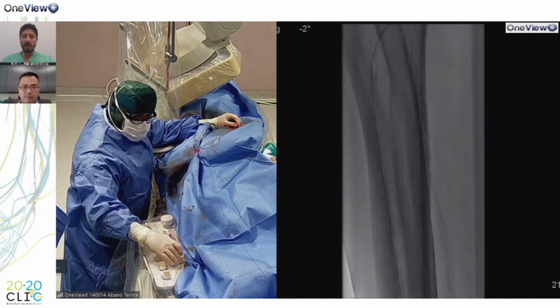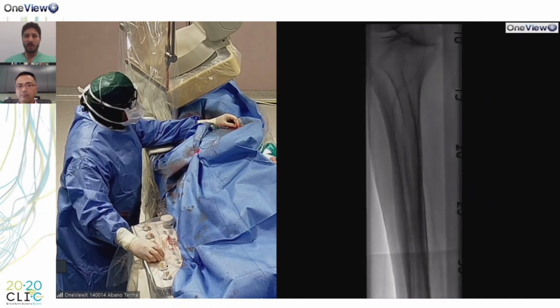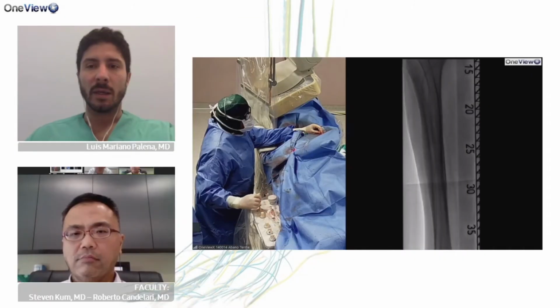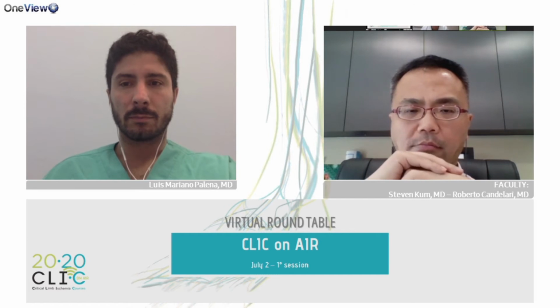Okay, Marco, if you agree, we will see the control and we will move forward with Roberto's presentation about IVUS, and we will be back finally to see the last passages of the case. CO2? Yes, okay. Let's see the control, please, Sebastiano. Can we be back to the live case, please? Perfect, go with live, with the Jet Stream, please.